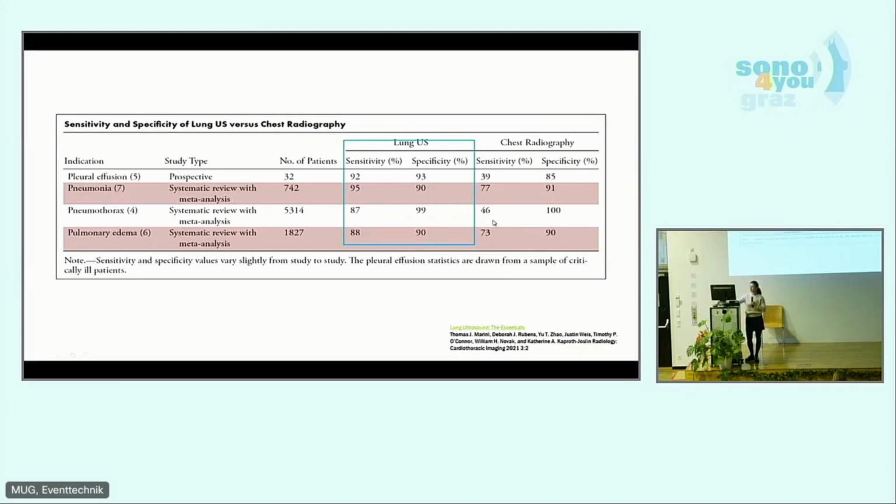What is really not good, it's devastating, is that the sensitivity in detection of, for instance, pleural effusion and pneumothorax is lower than 50%. So there is a 50% or higher chance that I am not going to see these two important things in chest radiography. Pneumothorax can be big, and tension pneumothorax is life-threatening. So I'm really bad at it.